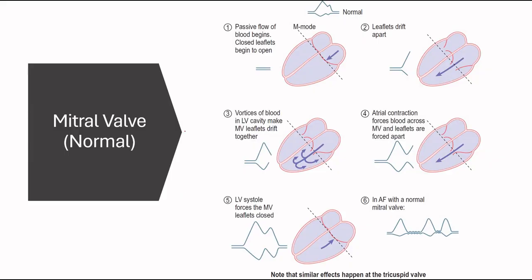Next we'll talk about the normal mitral valve through the M-mode. So this is what the normal looks like. One, we have diastole, so we have passive flow of blood, and it's still closed, but then the leaflets drift apart, so you can see that these are more apart, as the blood flows through passively, and then afterwards the blood in the LV cavity flows back a little bit, so it makes the leaflet drift back together.